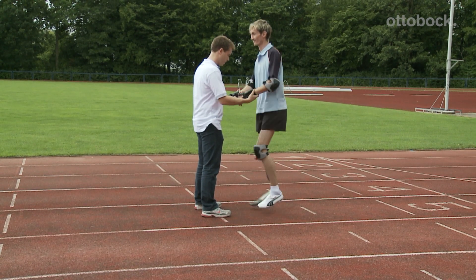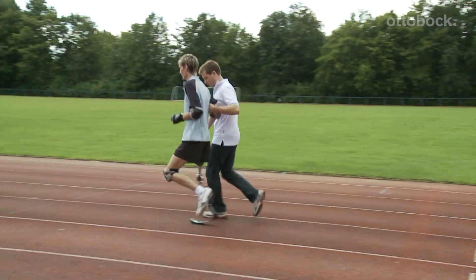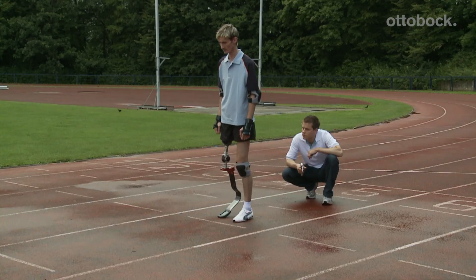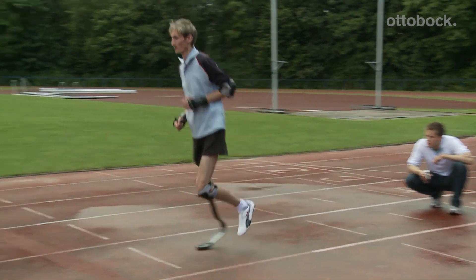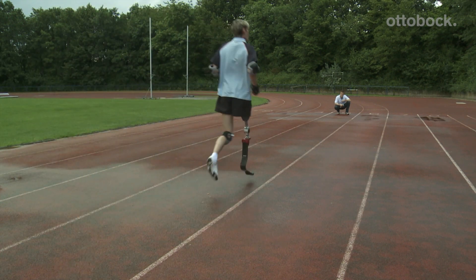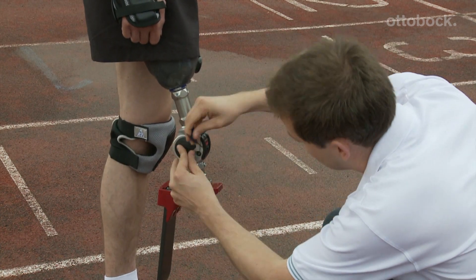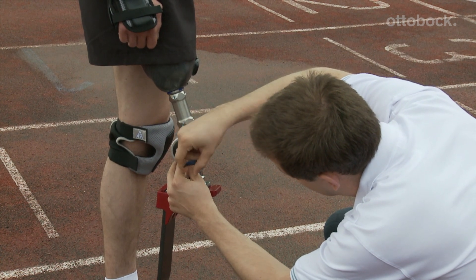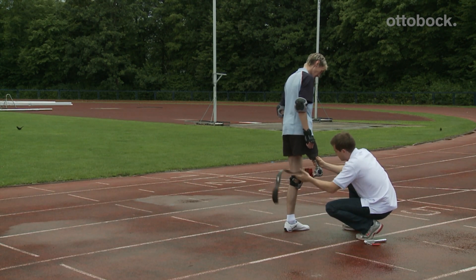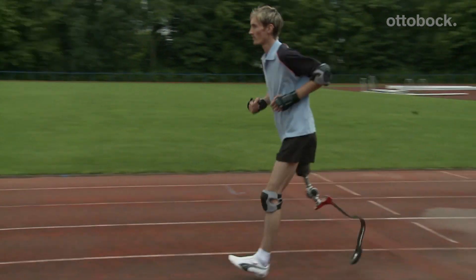The user can now practice running outside. It is necessary to support the user at the beginning. An all-weather running track is optimal as a soft and level surface. At the beginning, take recurring breaks and slowly build up the routine. If the user has learned to handle the prosthesis safely, the prosthesis solution can now be checked and optimized again. It is necessary to check whether an appropriate step rhythm exists and a correct stride length occurs. The hip potential of the runner should be fully exploited and the entire surface of the foot must touch the ground. Since real forces operate on the spring, it is necessary to check again whether the flexibility of the spring is appropriate. Practicing safe stopping is essential and should be practiced repeatedly.